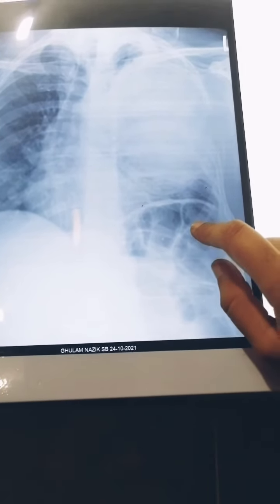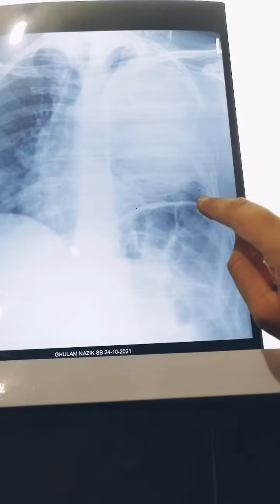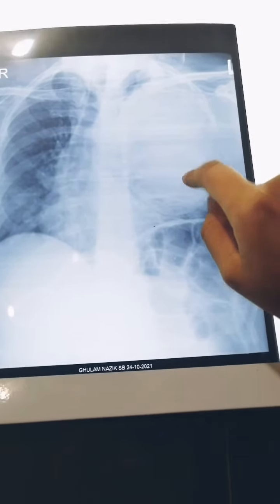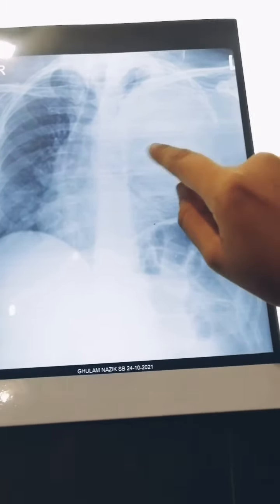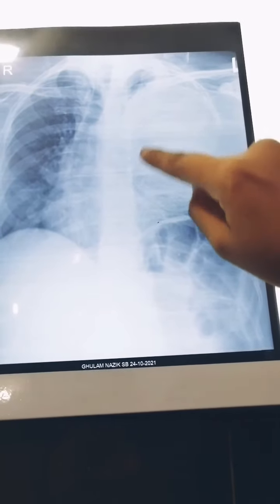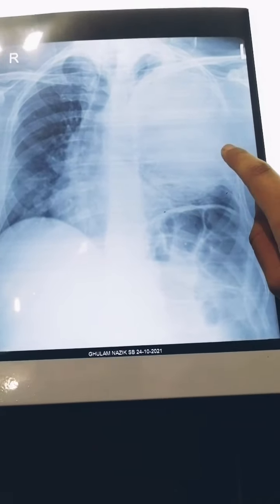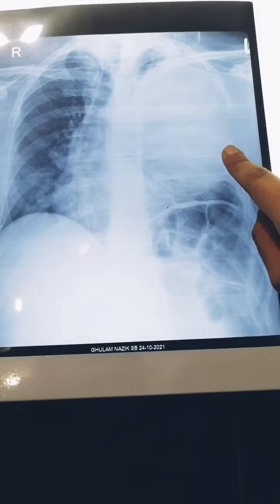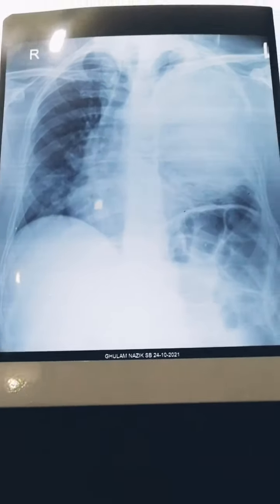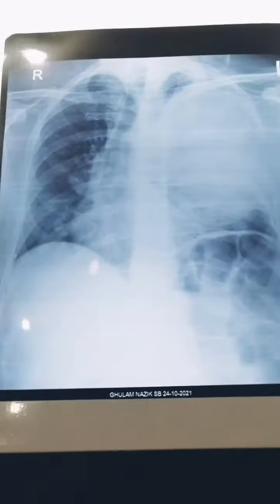But as you can see, the opacity is in the middle and upper part — not the lower part. So this is most probably a mass in the left lung which is pushing the trachea to the right side.